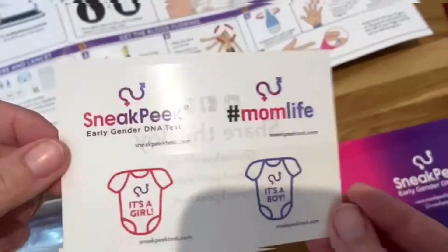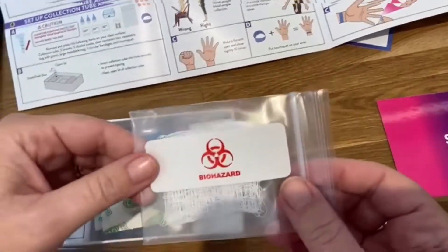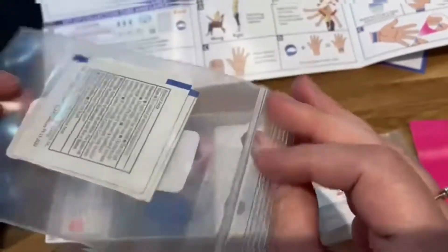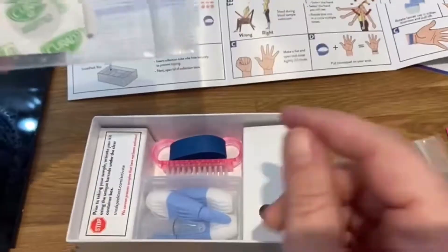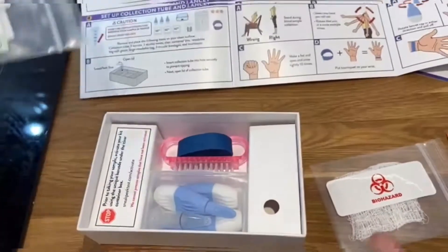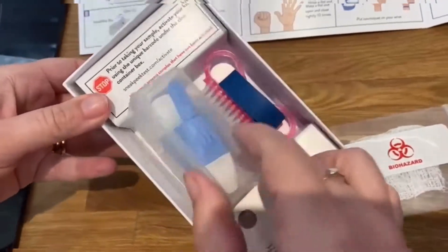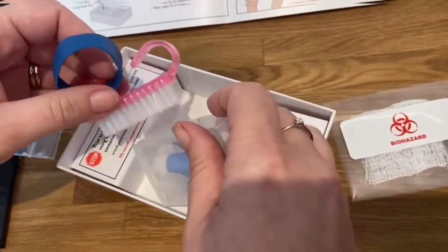So there are just two stickers — we don't know what it is yet. There's also this item, which I wasn't sure about at first, but it turns out it's a wrist strap. The instructions say to clean your fingernails, which I've done, and then this wrist strap goes around your wrist. This is actually quite scary.